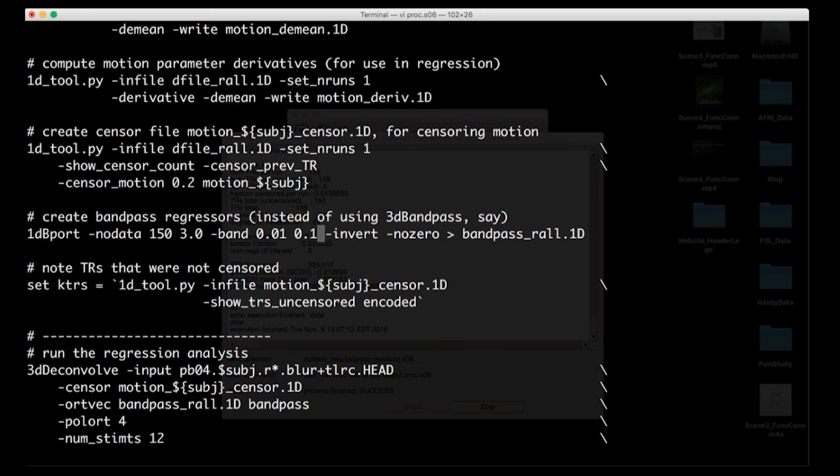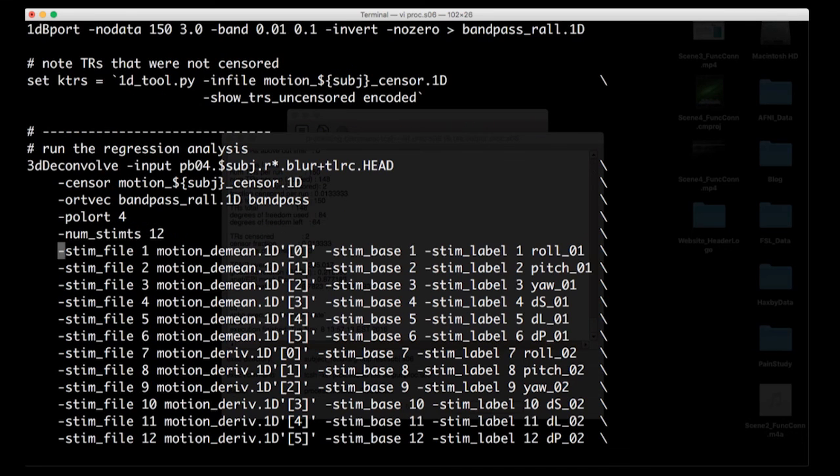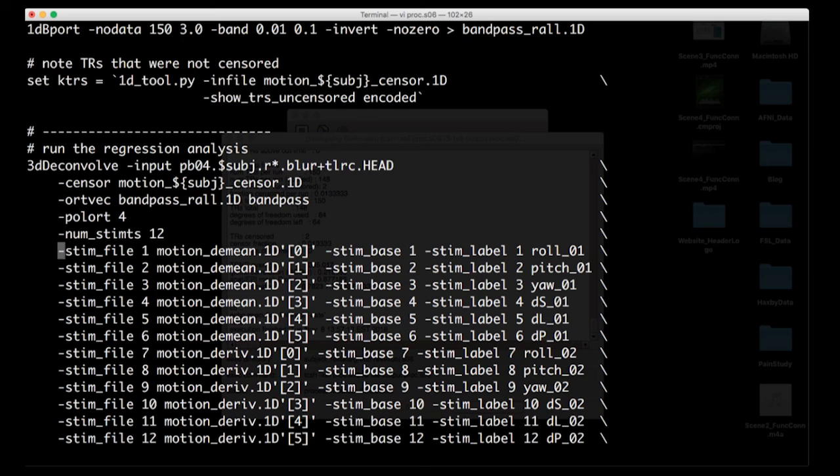And what this is going to do, this command right here, it's going to then take the inverse or the opposite of those frequencies. So everything outside of that frequency domain, everything that is a higher hertz than 0.1, everything that's a lower hertz than 0.01. And it's going to create a series of frequencies that we want to filter out. Remember the really high frequencies and really low frequencies, we want to filter out from our data because those are sources of noise and we don't want them to get confounded with the resting state signal.